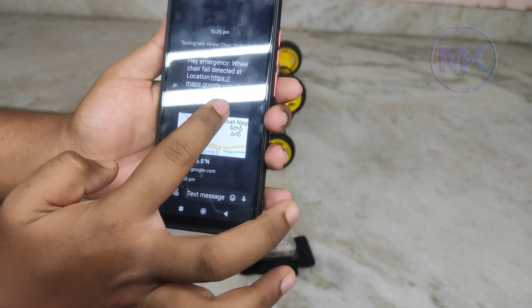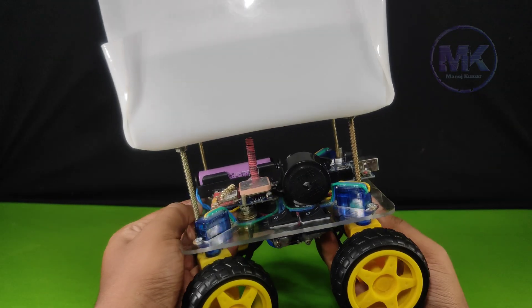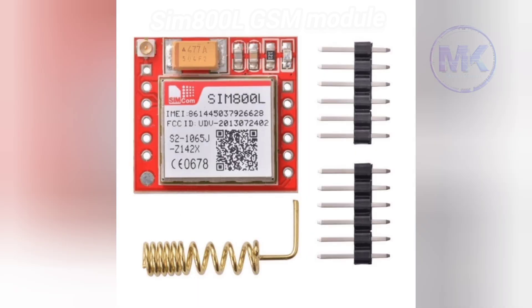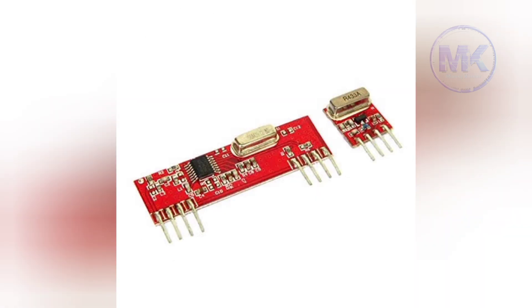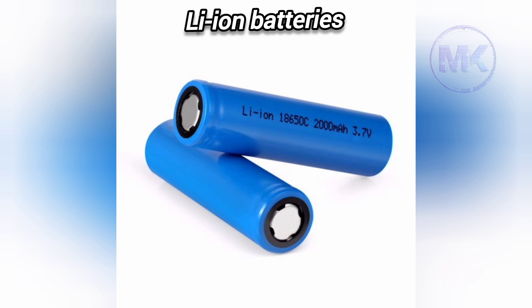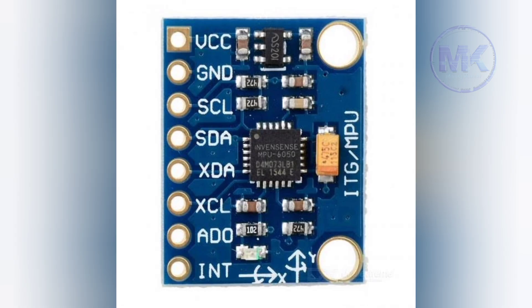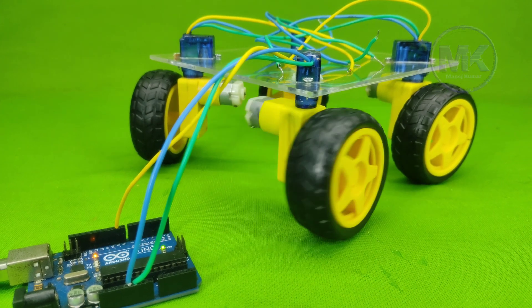The components used in this wheelchair are: Arduino Uno, SIM800L GSM module, GPS module, 433 MHz RF module pair, servo motors, DC geared motors, buzzer, lithium-ion batteries, L298N motor driver module, and MPU6050 accelerometer sensor.